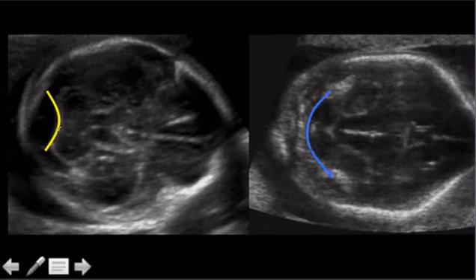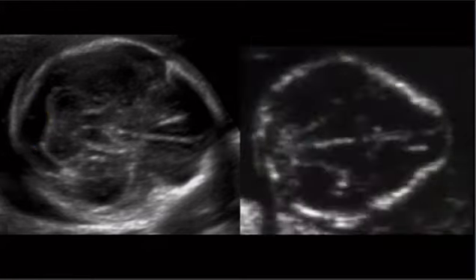Another thing to mention is that you see how we've got normal cisterna magna CSF space back here? We don't see that. It's crowded. So that's the supposed pathophysiology: you've got a lumbar spinal myelomeningocele leaking CSF, and that's creating a hypotension in the subarachnoid space, which then results in a prolapse of the cerebellum into the foramen magnum, and it reverses the shape because it's smashed down in there.